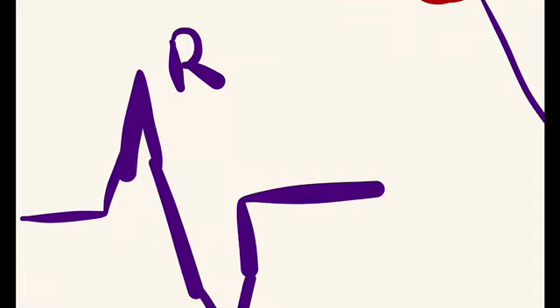The change is the T wave inversion. In right ventricular hypertrophy, you can see the T wave inversion in which leads? V1, V2, V3 and V4. But in the infarction, there is no hypertrophy, so you will not see the T wave inversion here. That was a characteristic finding. That is how you can differentiate between right ventricular hypertrophy and posterior wall infarction.